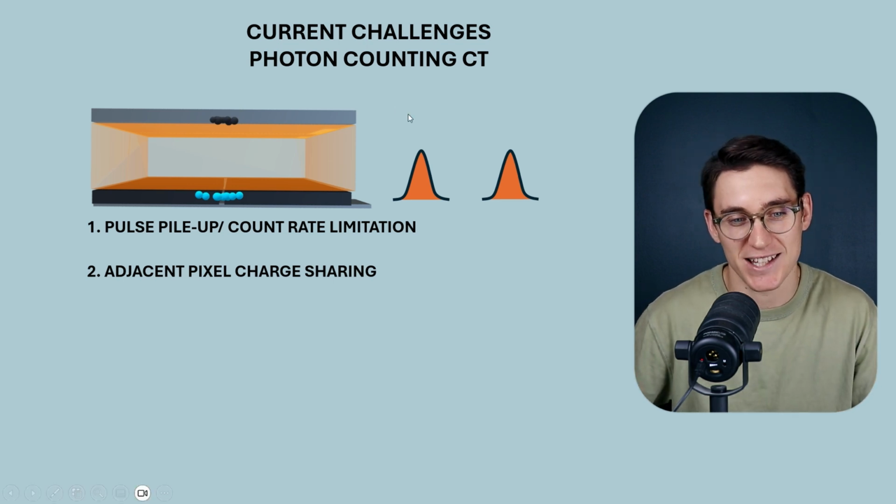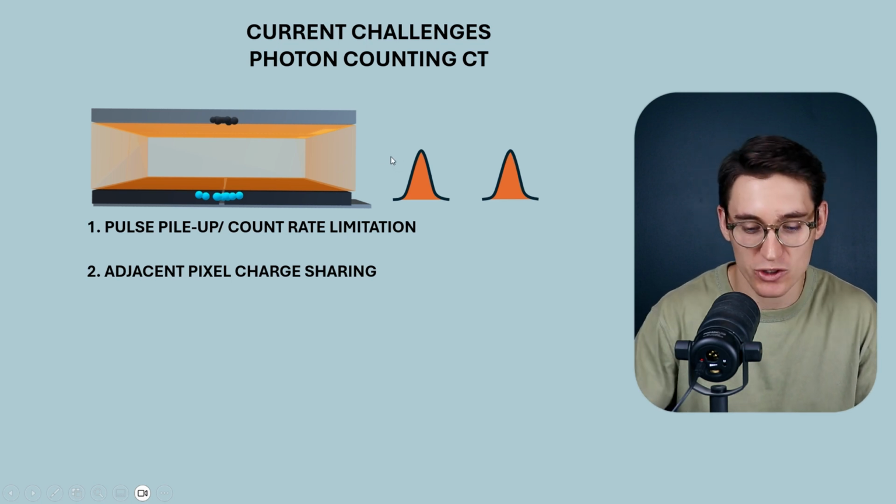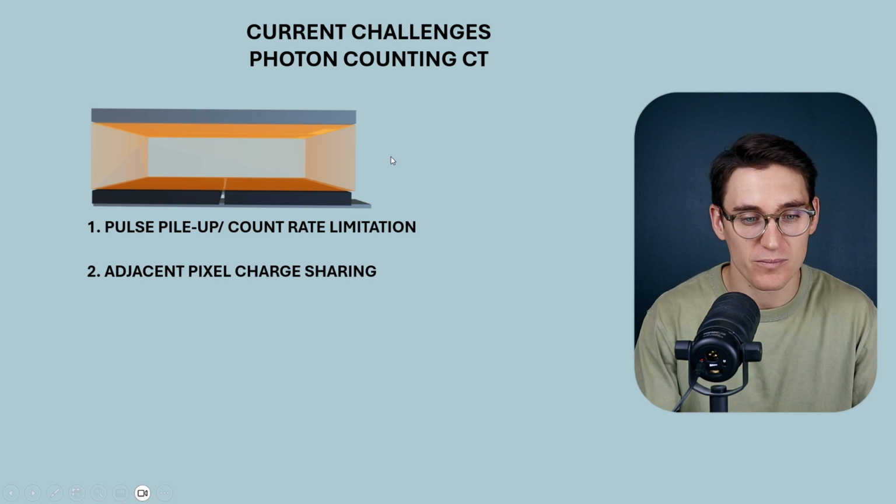We're going to say that this X-ray photon was half the X-ray energy that it was truly. So we're not truly representing that X-ray energy.